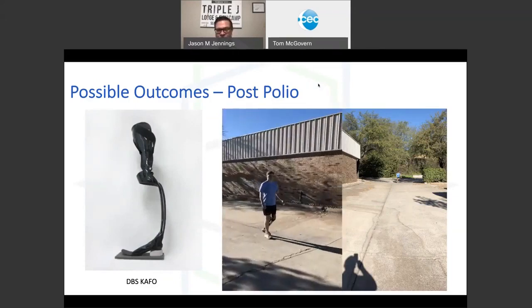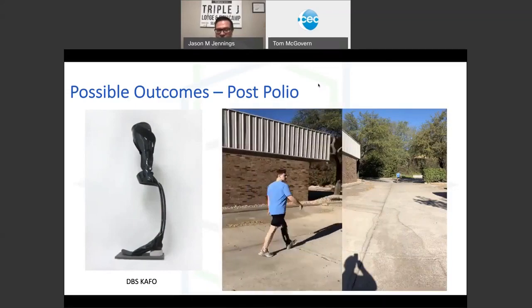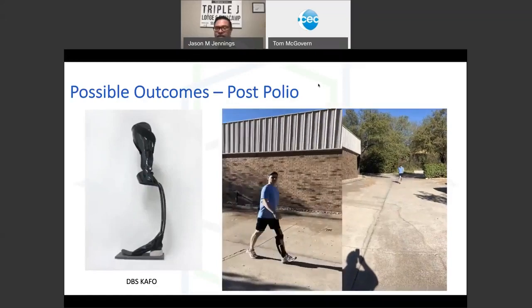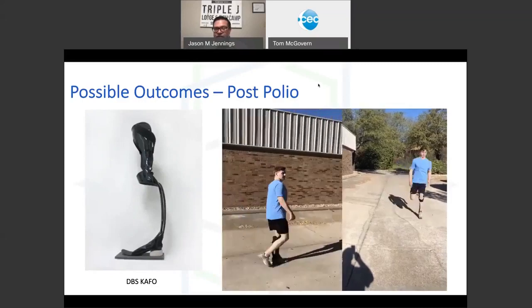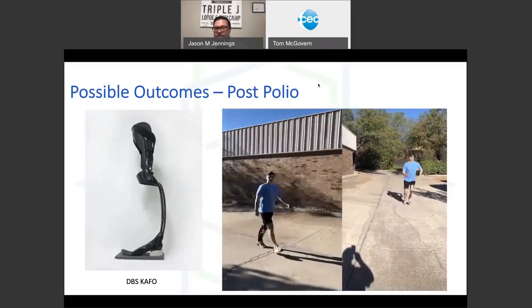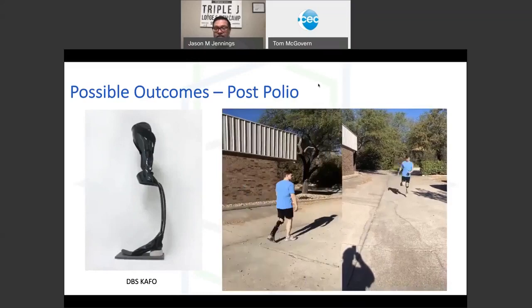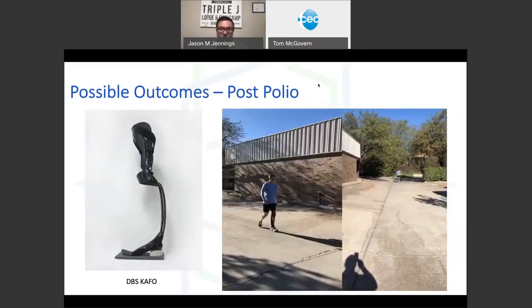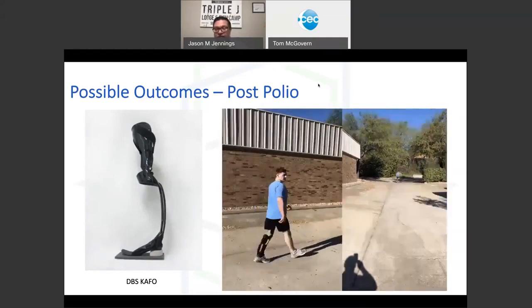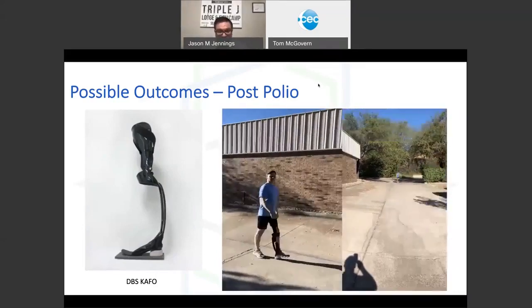And obviously, we've controlled his triplanar deformity at the foot and ankle and knee and got everything aligned so that it tracks straight and true. And then with the improved alignment and stability of the brace, he's actually able to run. And I challenge anybody to show me that with a polypropylene KAFO. So I think that's a great observation of what can happen when you realign and establish alignments with your orthotic design, provide appropriate materials, and just do a good job.